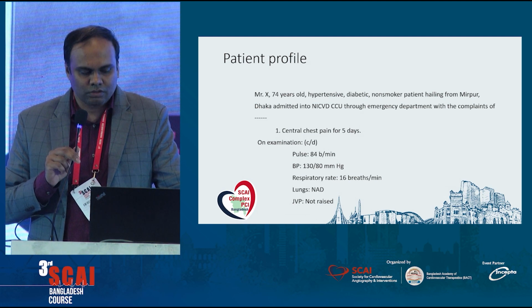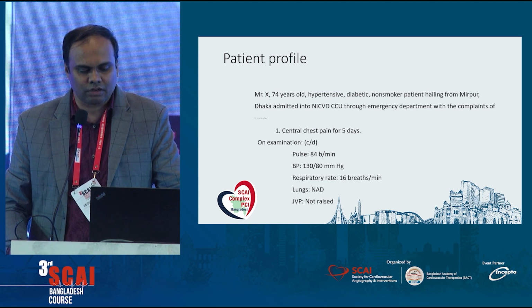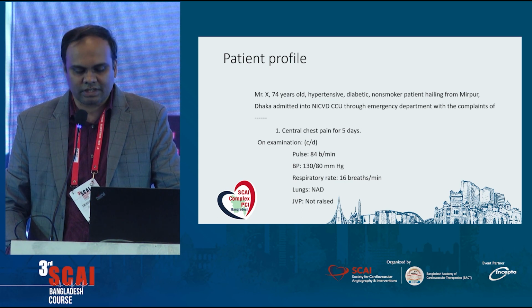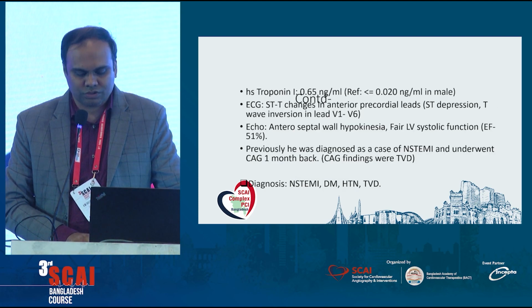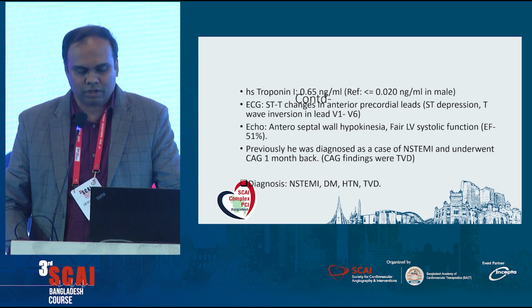This is the right side. We showed a heavily calcified RCA, and from proximal to distal it looks almost like a stented vessel, a tube of calcium. On the left side, it showed significant proximal LAD disease and also downstream disease, and the LCX has some borderline disease. The SYNTAX score was calculated; these are intermediate lesions. We counseled the patient party about the benefits, but the patient planned to go for PCI.